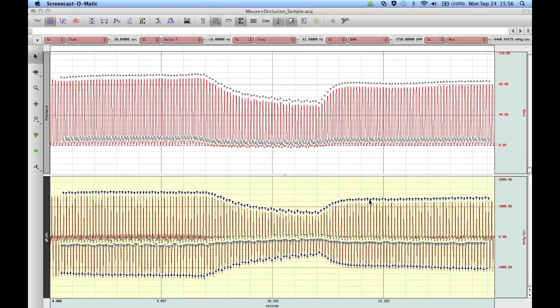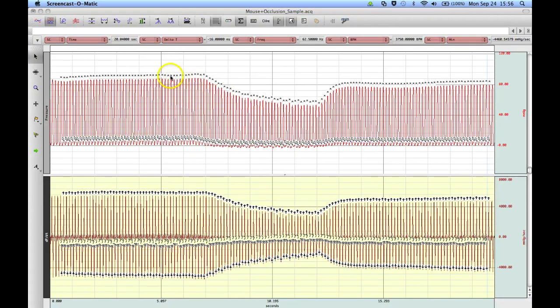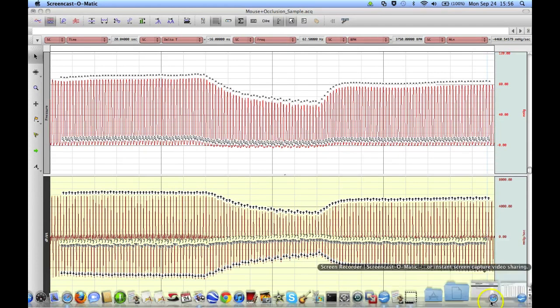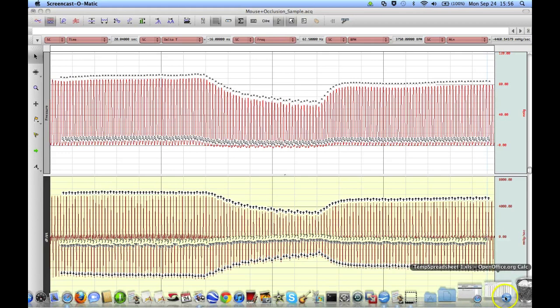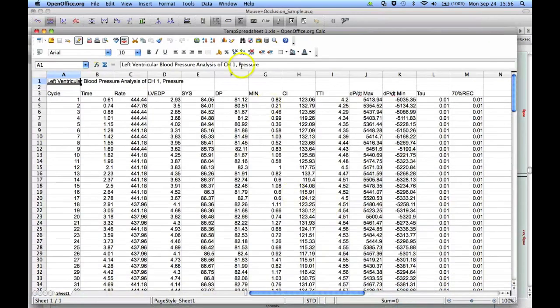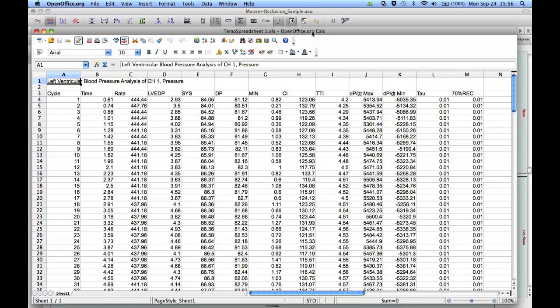Once the analysis is complete, you will end up with two channels: the original left ventricular pressure signal and then the derivative. And in both cases, you can see how Acknowledge has scored the data and put event marks in at the appropriate points. And down below, we should also have a copy of the spreadsheet with the results.